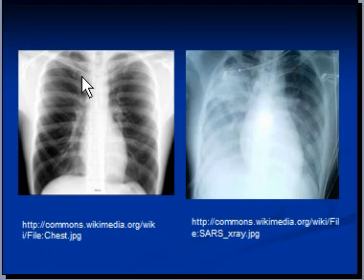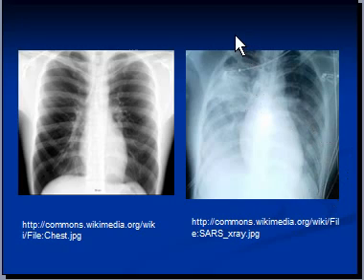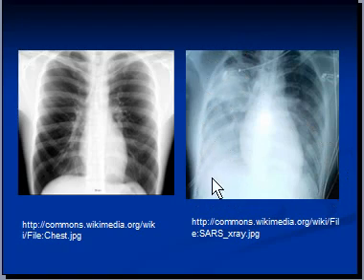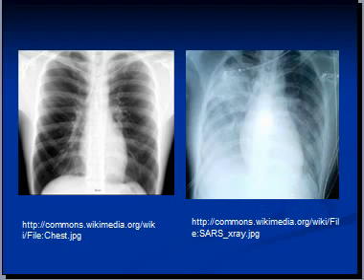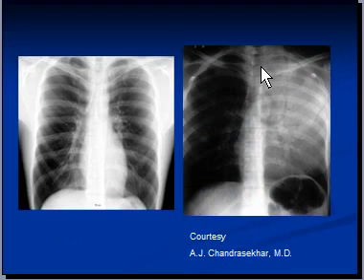This is a normal chest X-ray — that is how the lungs should appear. This abnormal chest X-ray shows areas of consolidation in both lungs; the right hemidiaphragm is not visible, and this area of lung is also consolidated.